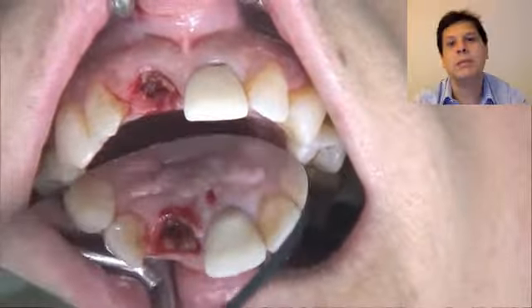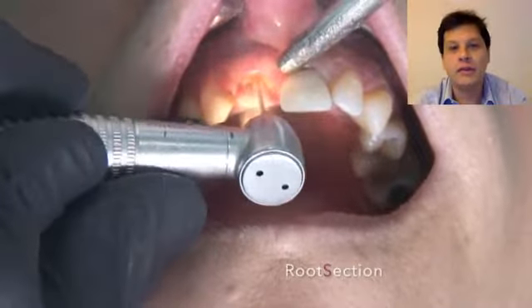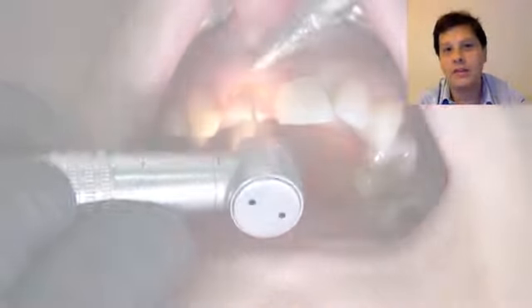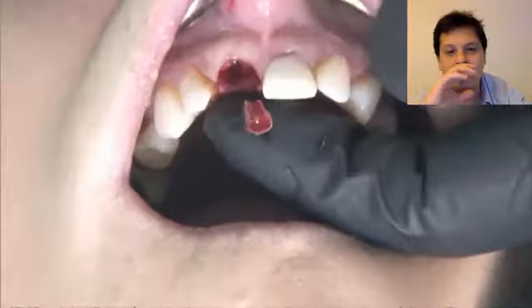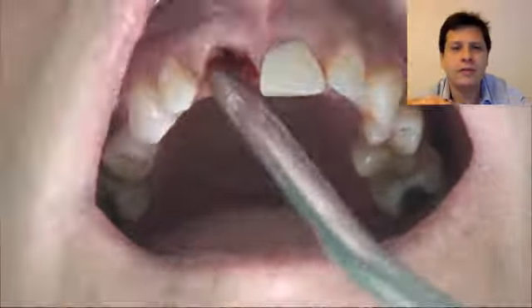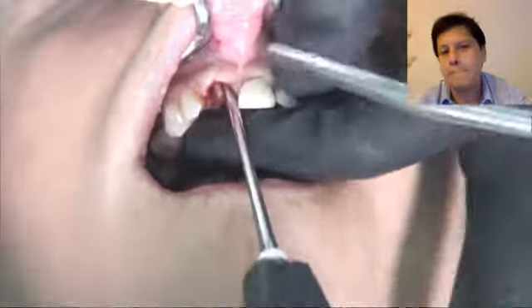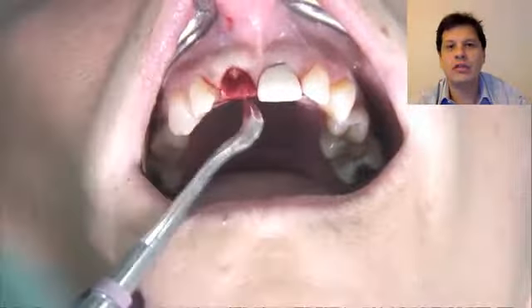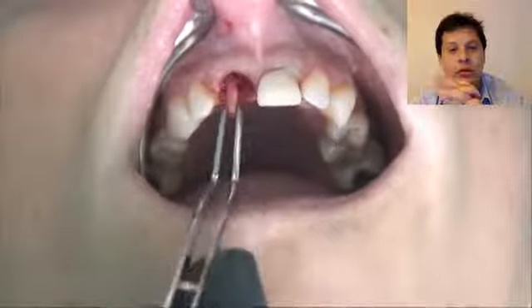Now, of course, when we are talking about single unit implants and small multiple units, the fit of these things is almost perfect. I'm going to show you later on what happens in full mouth rehabilitation, which still has some problems. Now, in single units, it's very predictable. That means that you can extract the tooth, plan your surgical guide, and then on the day of the surgery, everything falls into place very beautifully. So this is the objective.